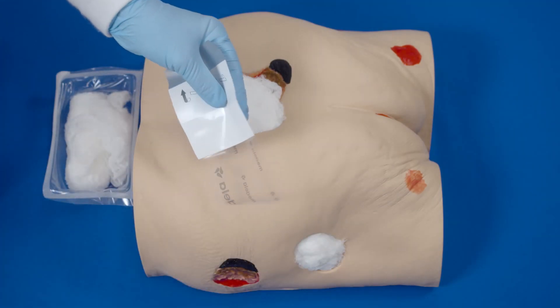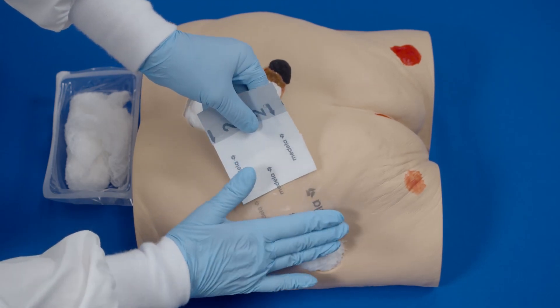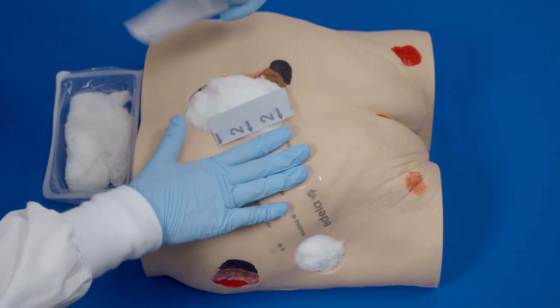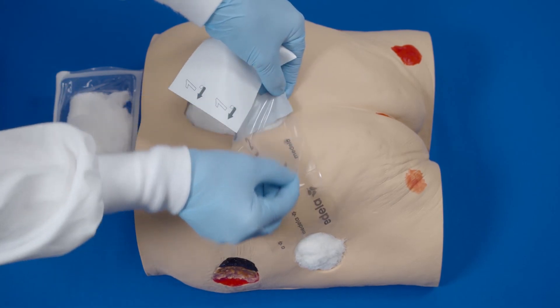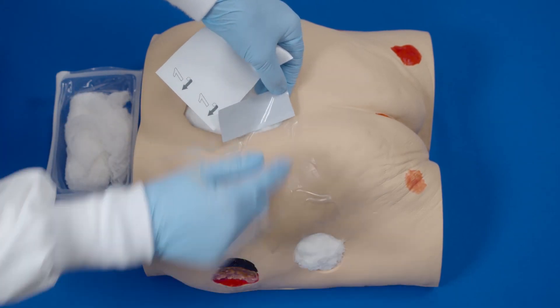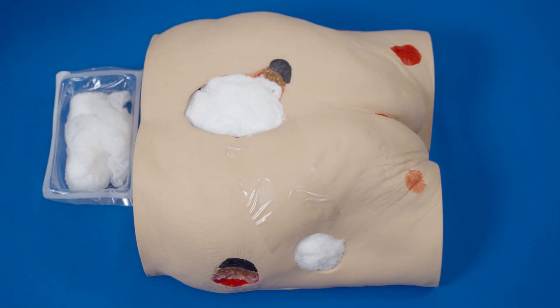Apply transparent film over any intact skin between the two wounds where the bridge will be placed. Partially peel back one side of layer one and place adhesive side down, then remove the remaining side of layer one. Now remove the backing — layer two — by removing the perforated silver-colored tab on the side.